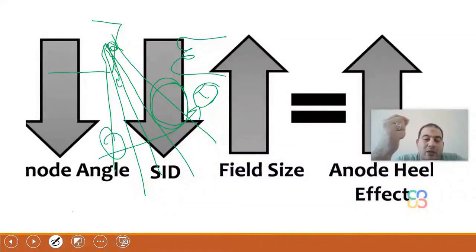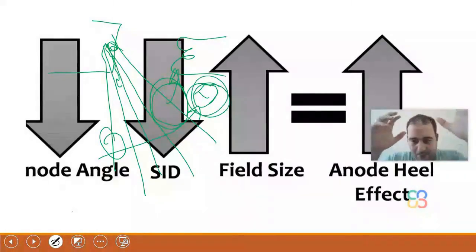Therefore, to achieve effective small focal spots, you need a small anode angle. Thus, you will find that the issue here is in the design of the X-ray tube. We utilize the concept of the anode heel effect and specifically tilt the X-ray tube so that the area near the cathode, which has very high intensity, remains focused on the chest wall of the breast we are imaging.